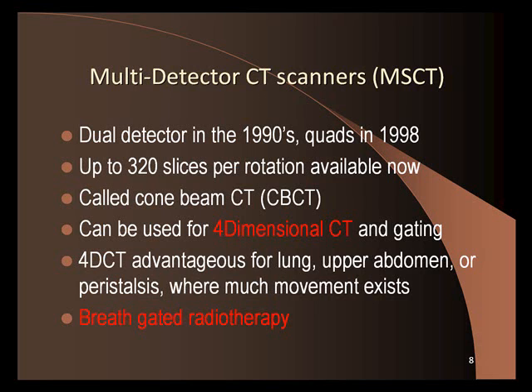That was the rule for many years. There is one row of detectors, and as one rotation occurs, these detectors create one slice.